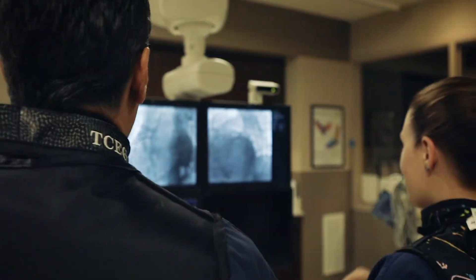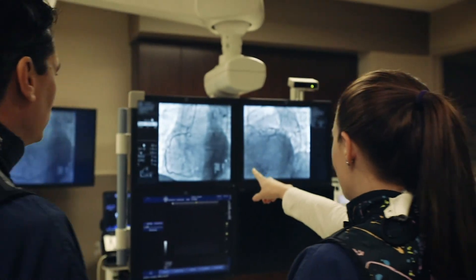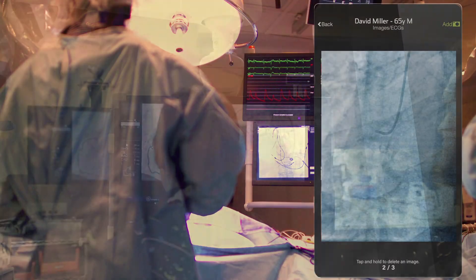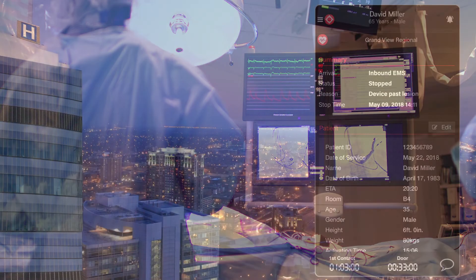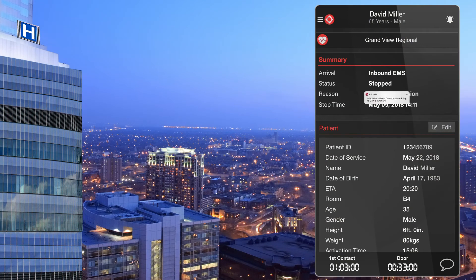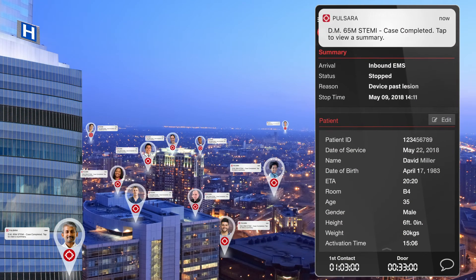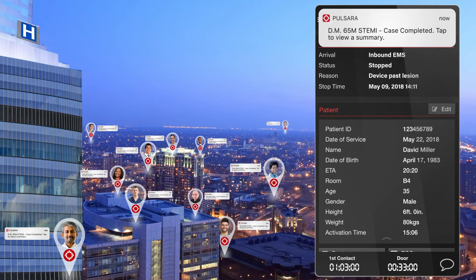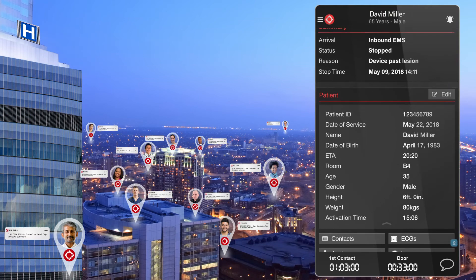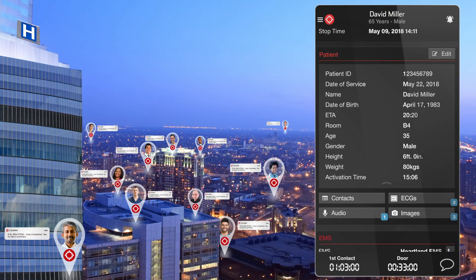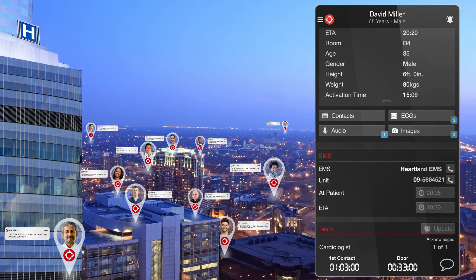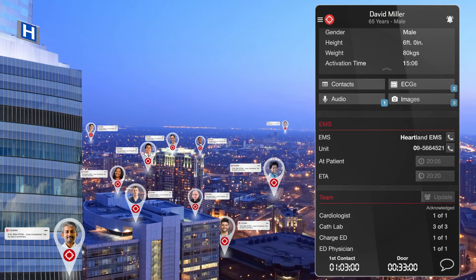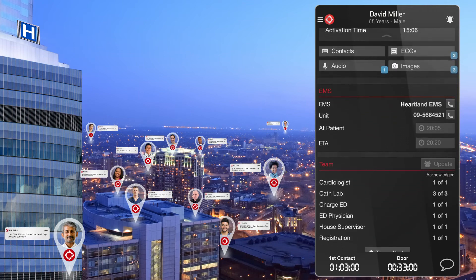When the case is completed, the cardiovascular team has the option of adding before and after cath images and dictating a quick summary that immediately goes back to all team members that participated in this patient's care. This real-time feedback is critical for ongoing education as well as promoting improved team dynamics.